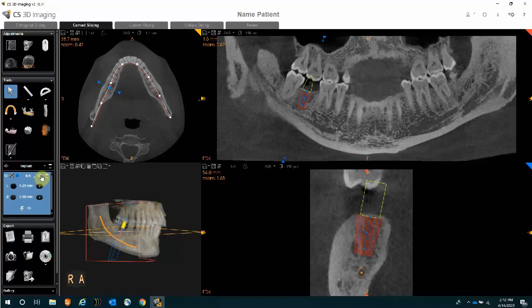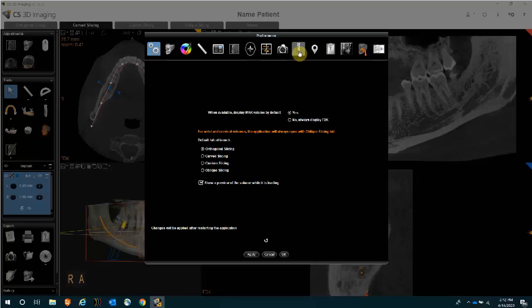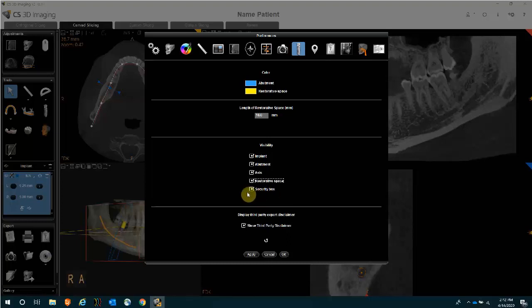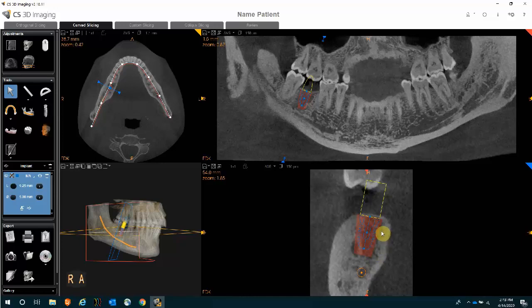It is helpful to go to your preferences in the upper right-hand side and select the implant tool in preferences. This is where you can indicate which portions of the implant you would like to display — for example, you can check or uncheck the restorative space or the abutment. One option here is the security box, which is enabled by default — this is why you may see a red glow around the implant, which indicates that the implant is either too close to the neighboring tooth, too close to the nerve, or potentially outside of the bone. This is your safety box and is an excellent tool.